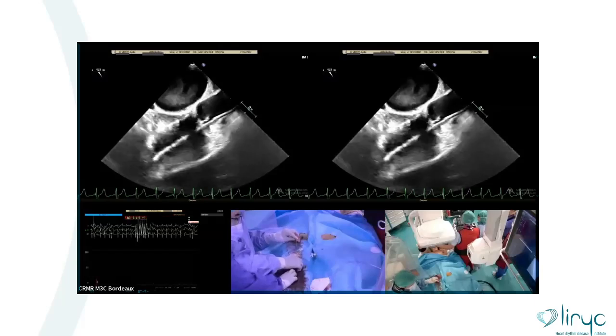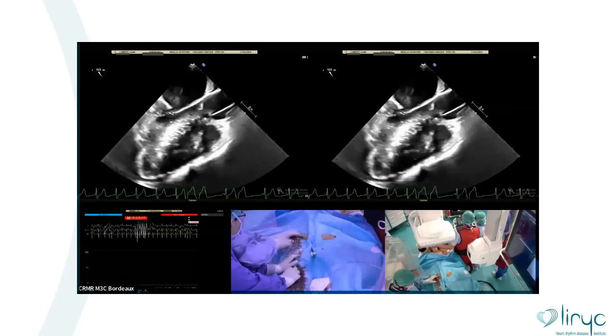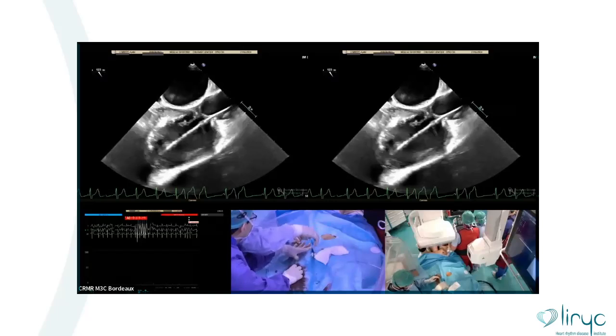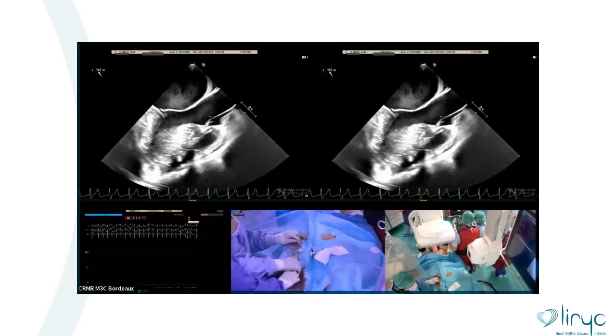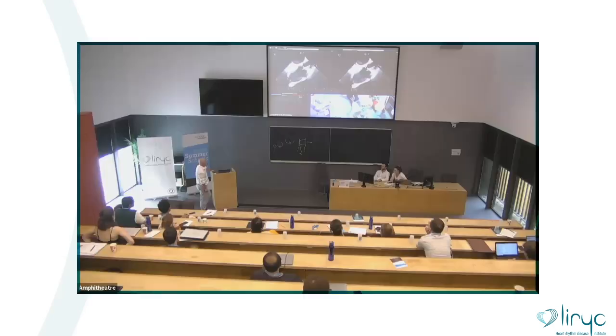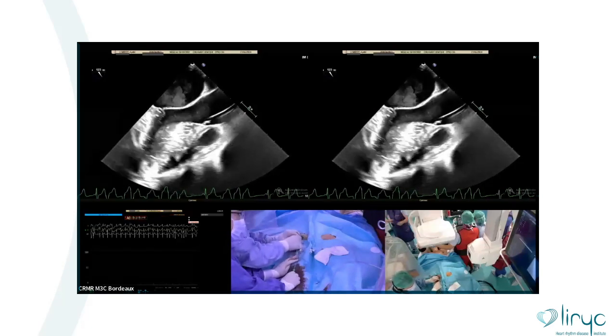So Mark, can you see the position of the sheath? If the VSD is very small, don't do this, okay? I measure again. Yes, we see the marker. The guide is there. You haven't reached. Can you still go ahead? You should still advance. You haven't passed. I think it's okay now.